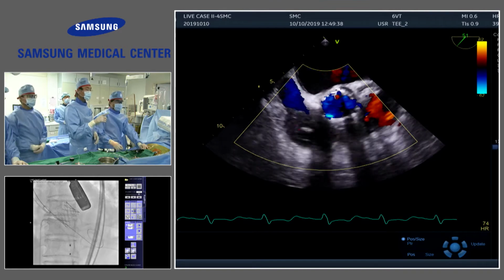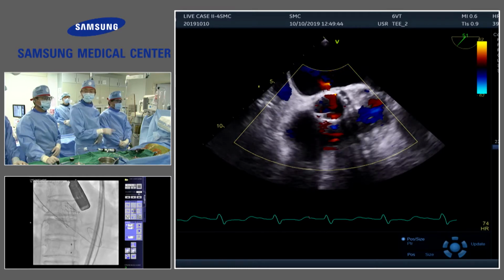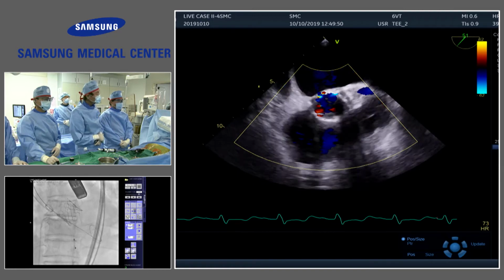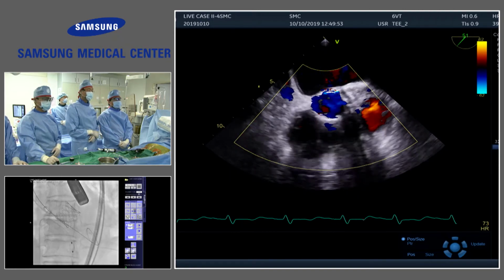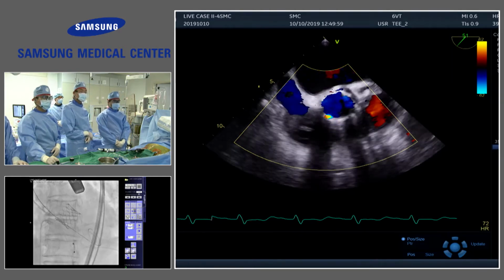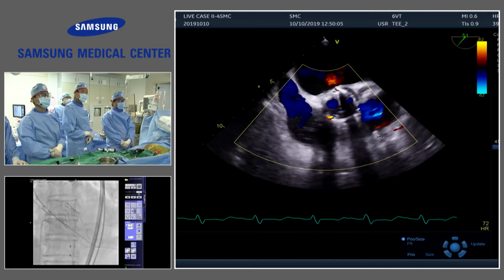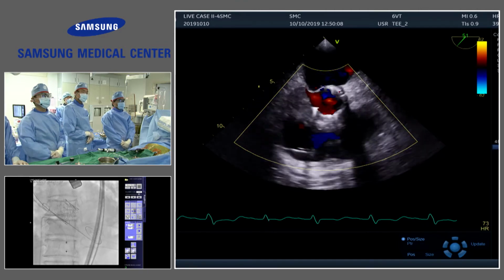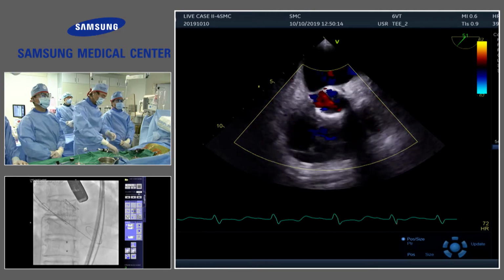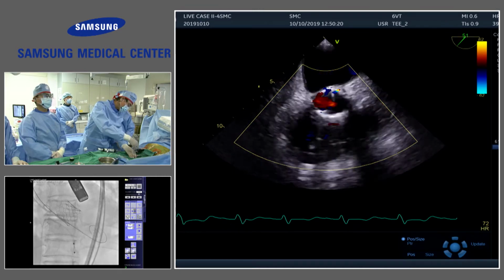actually I'd like to show the TEE. Today's Eun-Kyung Kim, our echocardiography specialist. Can you show her? Yes, working on it. Good morning. And besides, we have the anesthesiologist, Dr. Min. Say hello. Okay, please now explain it. We can see the probable mild AR from 7 o'clock to 1 o'clock, but the AR flow observed at 7 o'clock might be wire-related AR, so the total amount of AR is thought to be mild now. Okay.